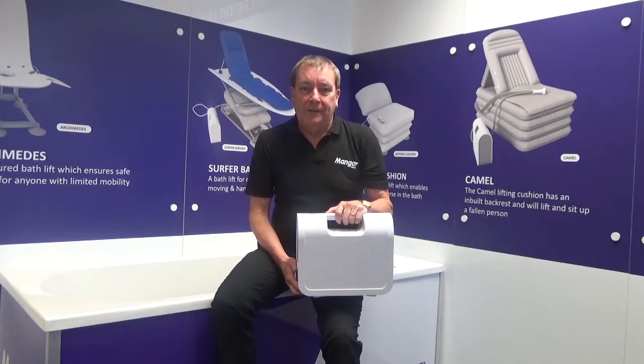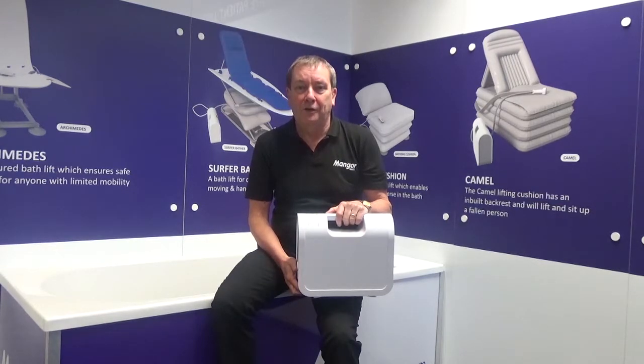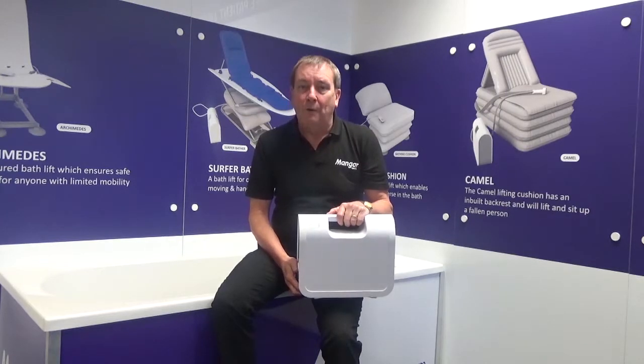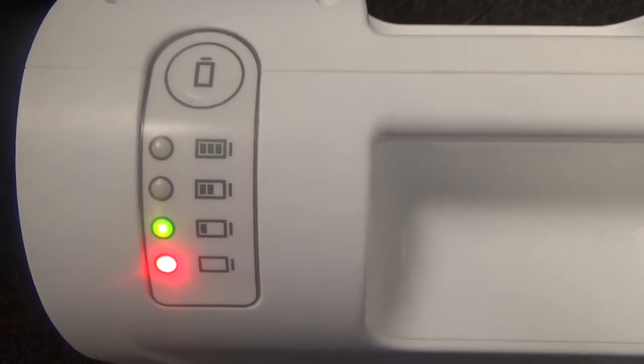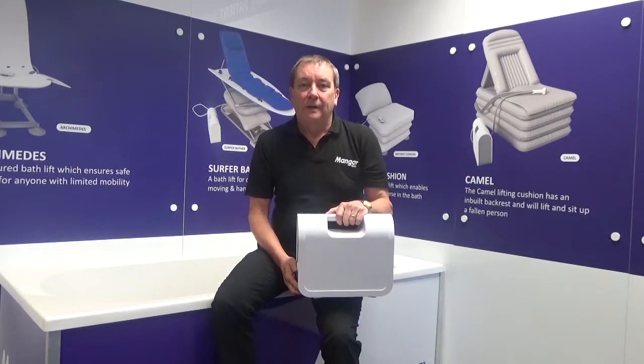Once the charger is connected to the mains, the battery light indicator on the Airflow will start to give us information as to how far the charging process has been completed. For the first two hours we're only going to see the red light and one flashing light above it. After that two-hour period the charge continues to build until, after a full 16 hours, the compressor will be fully charged and all four lights will be showing green.